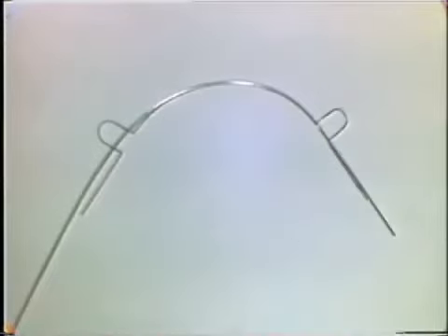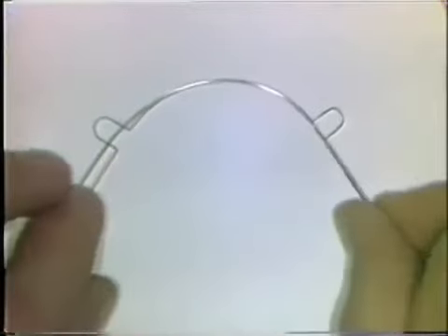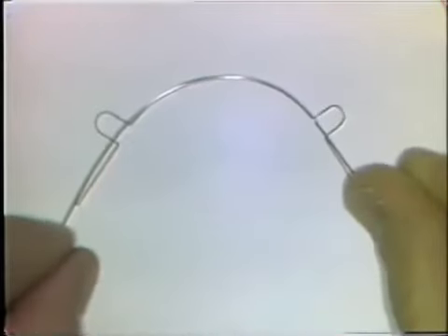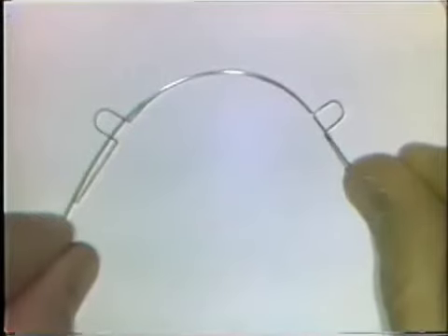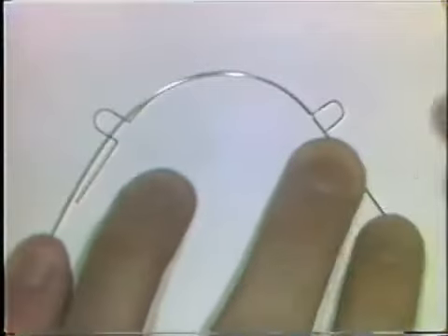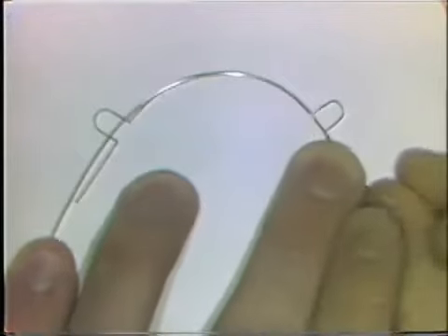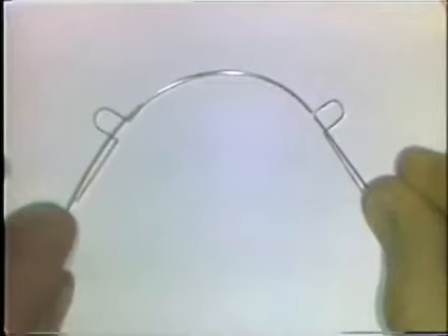To bend the second exercise pattern, you start by forming a smooth curve that is flat on the tabletop, that's in the same plane of space. And you place the curve that you've formed over the pattern. Be sure you mark the spot where one of the loops is going to begin so that you can always return the wire to the exact same spot on the pattern when you're making adjustments.